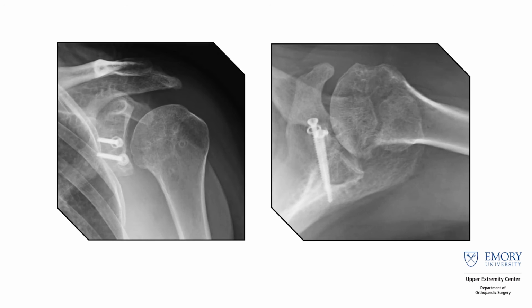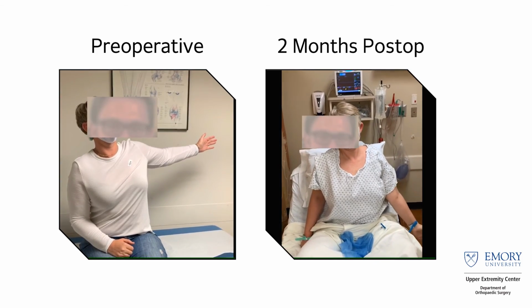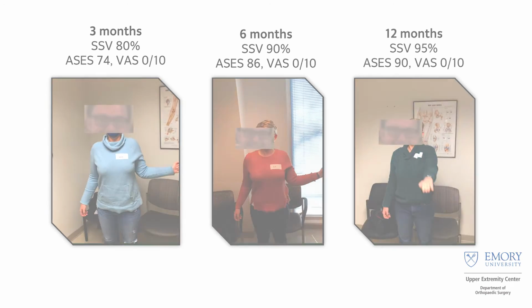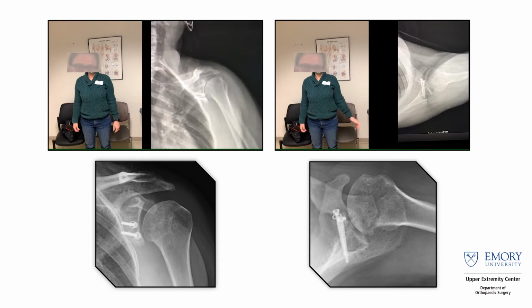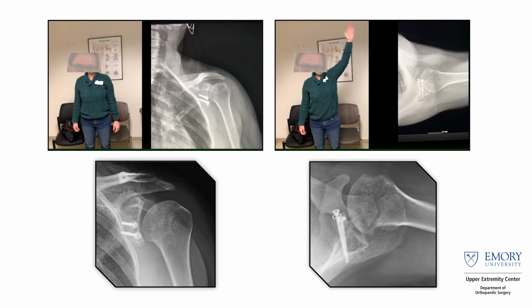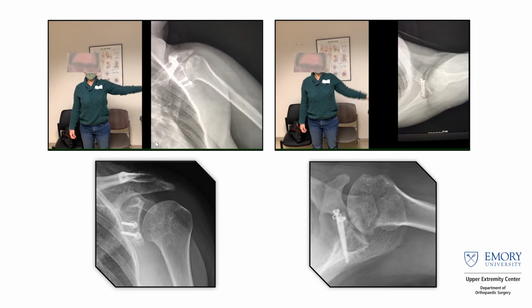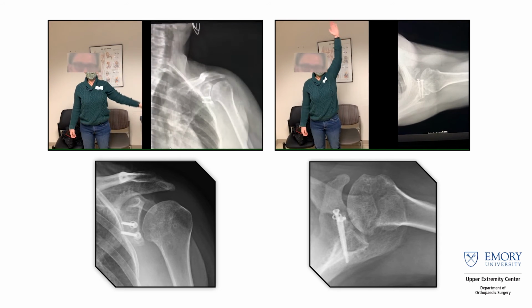You can see our post-op x-rays look pretty good. Post-operatively, she was able to get back to fairly good motion. She was able to return back to her work as a collegiate volleyball ref. Basically very little limitations. The cool thing about the DDR is you can actually see what's going on, how she actually stayed inside the joint, and she's actually centered over that distal tibia allograft you can see in the upper right. On the X-ray view, it also kind of shows how, legitimately, what we did is we didn't necessarily recenter that well. What we did is we created a bigger surface area for her to now function on.